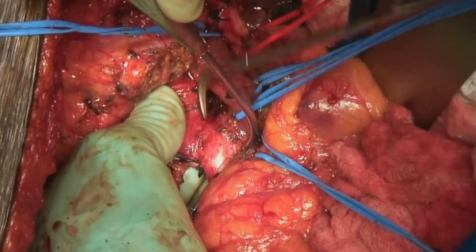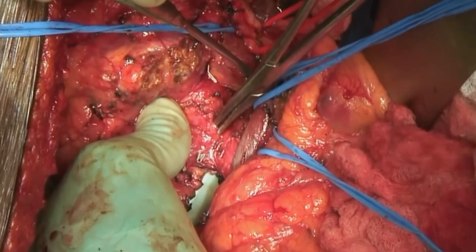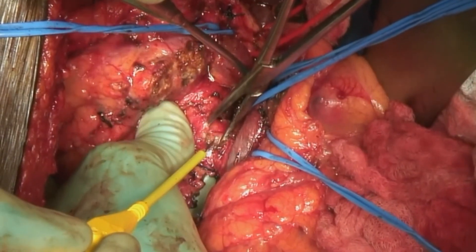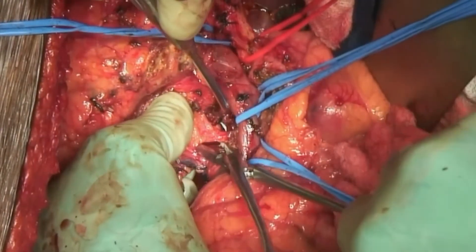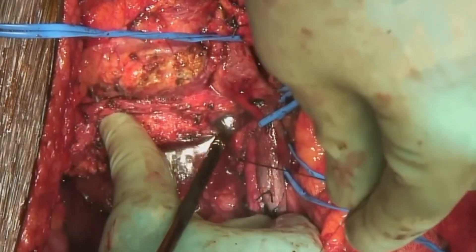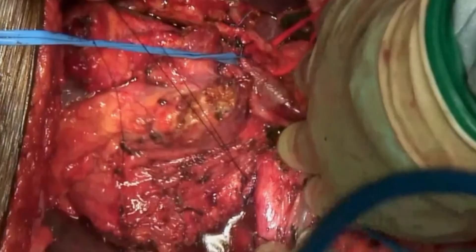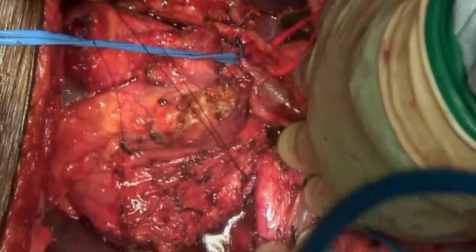Here we have a nice view of the surgeon's left hand retracting the specimen to the patient's right and exposing the right side of the superior mesenteric artery for safe dissection. As dissection is carried deep to the superior mesenteric artery, the relatively avascular retroperitoneal tissues posterior to the artery may be transected using an energy device. At the end of dissection, the vein is pulled to the patient's left and the superior mesenteric artery is fully dissected free from the specimen. It should be noted that the tumor is still adherent to the cephalad aspect of the portal vein; however, this did not affect our ability to retract the vein to the left to perform the SMA dissection.